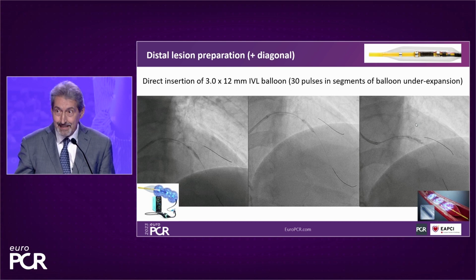This is theory. In reality, also in this case, it didn't work exactly the same way. Maybe I started a little bit more distal, so I did a single series because the balloon immediately expanded. But you see, when you see these areas where the balloon is severely indented and you need several pulses for the balloon to open up, you may need more than 20.